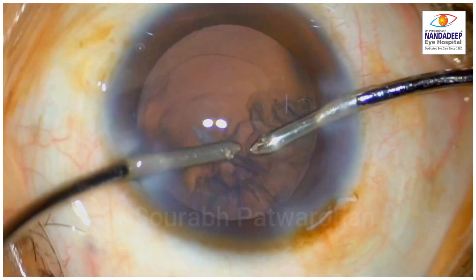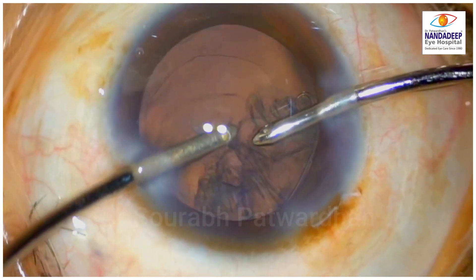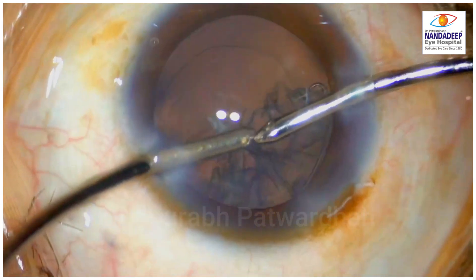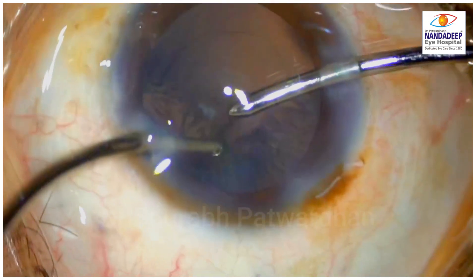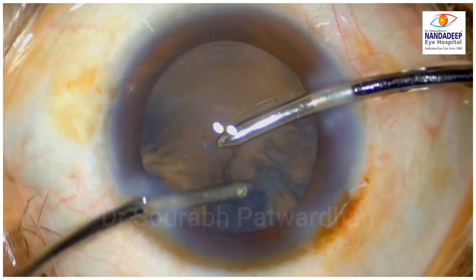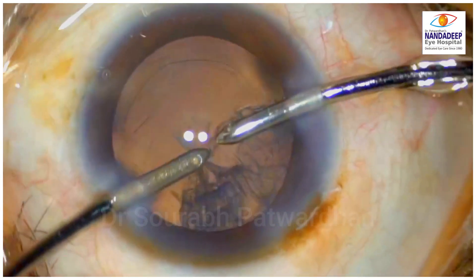What you notice here is that the surgeon is trying to pull this cortex centripetally. And in cases when the CTR is trapping this cortex, there is no point in pulling centripetally — it is not going to come out like that. Can you avoid cortex getting trapped by the CTR?